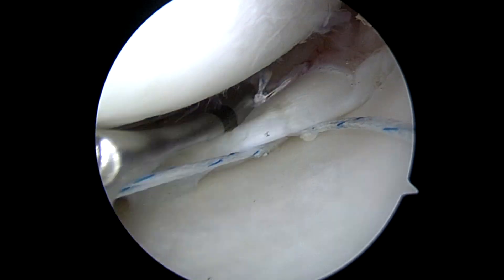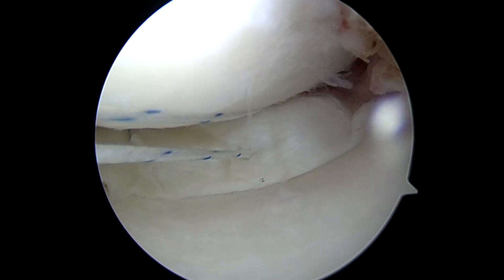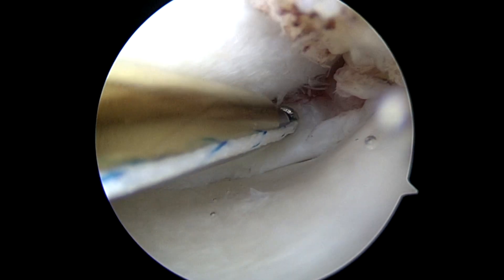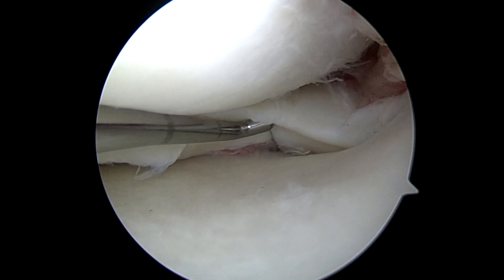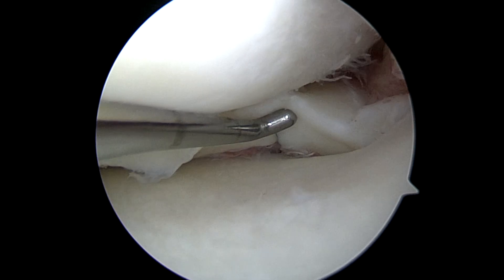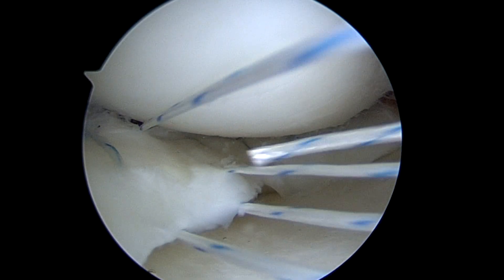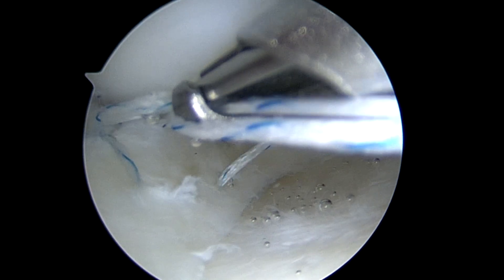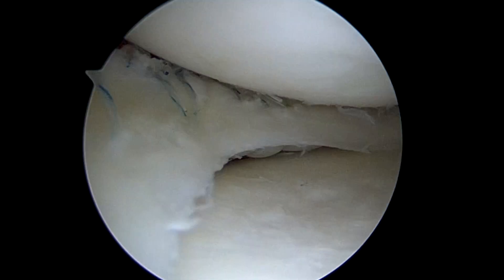First, sewing the posterior horn stitches placed behind the meniscus into the remnant and then through the meniscus, tied down with a Revo knot. The tibial side is easier to visualize here; the femoral side is also secured. It's a circumferential stitch, so it compresses both the femoral and tibial sides. Here's sewing the body region of the meniscus down — arthroscopic knot tied, cinched down tightly.